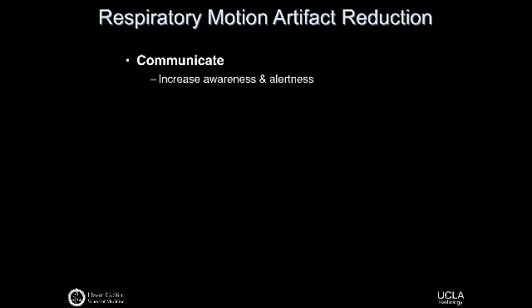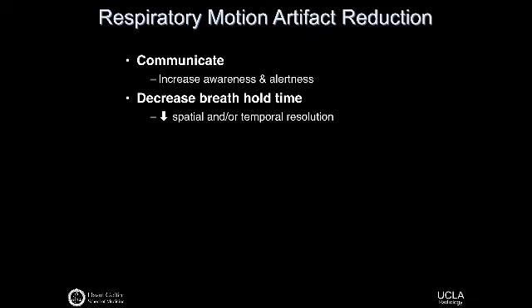Respiratory motion artifacts, there are ways to reduce them. These are relatively simple ways of communicating with the patient, making sure that they're holding their breath when you've asked them to and haven't just gotten really tired and sleepy. We'll do everything we can to decrease the breath hold time so that we can get images in a 15 or 20 second window for thoracic abdominal imaging typically. And then there's usually some kind of backup plan. You might do some averaging if you have to, if they really can't accommodate the breath hold requirements.